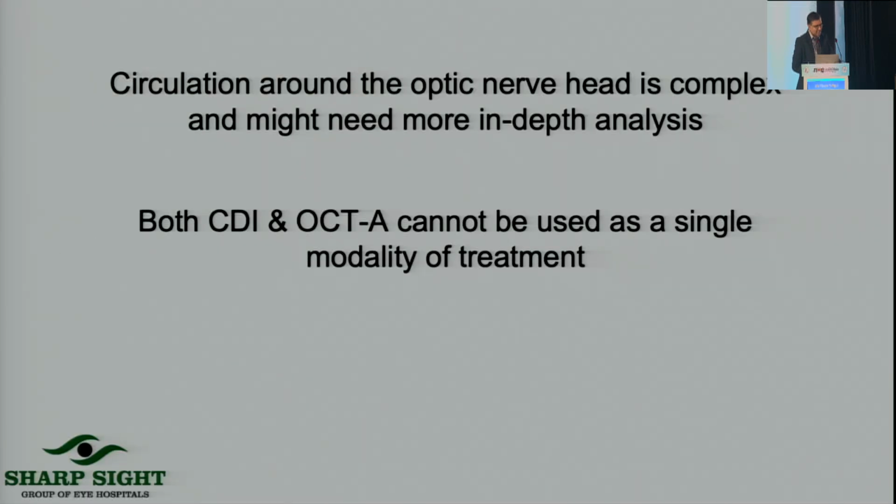My last slide: circulation around the optic nerve head is still complex and might need more in-depth analysis, and both color Doppler imaging and OCT angiography cannot be used as a single modality of treatment.